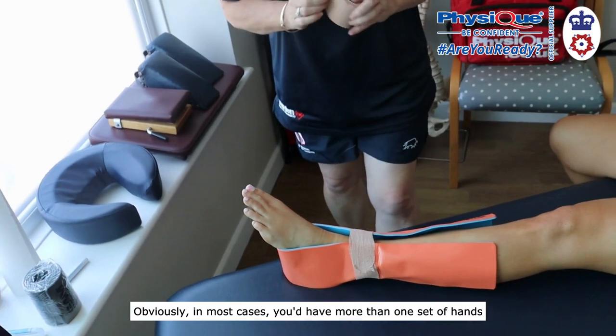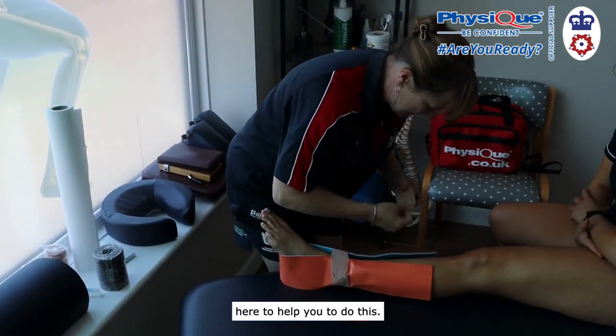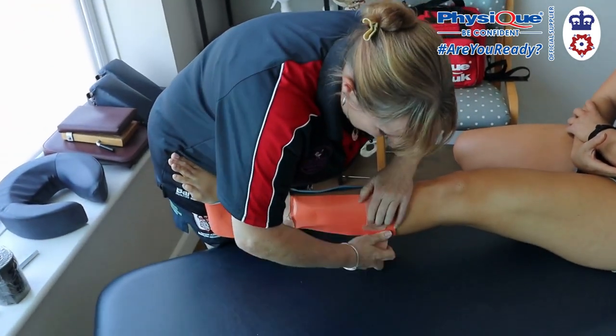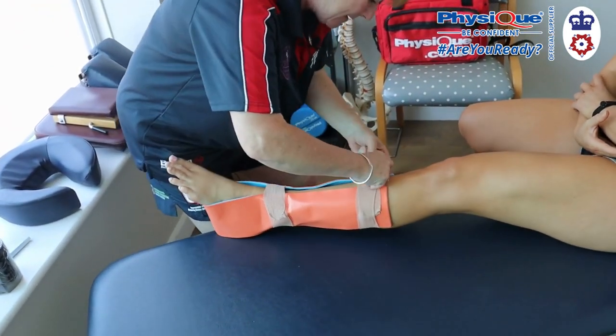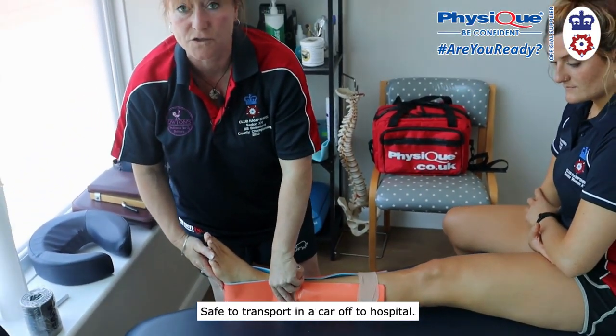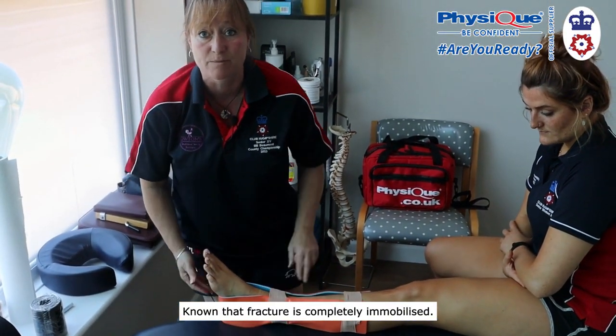Obviously in most cases you'd have more than one set of hands here to help you do this. There we go — and there she is, safe to transport in a car off to hospital, knowing that that fracture is completely immobilized.